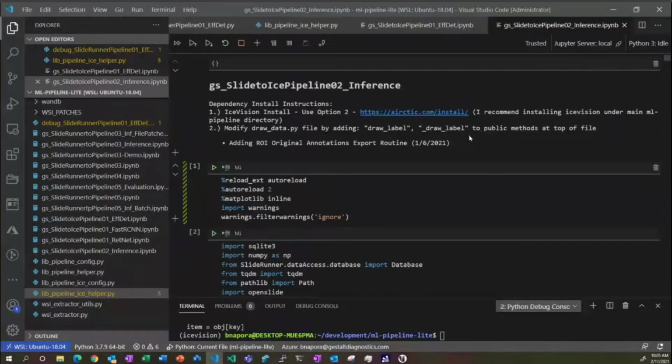But in general, you would definitely sample from the complete image, because then you would get better results on your validation set, I would say. I would think so. Okay, that's great. Bronzy is one of the contributors to the data set, so that's invaluable insight. Thank you. You're welcome.